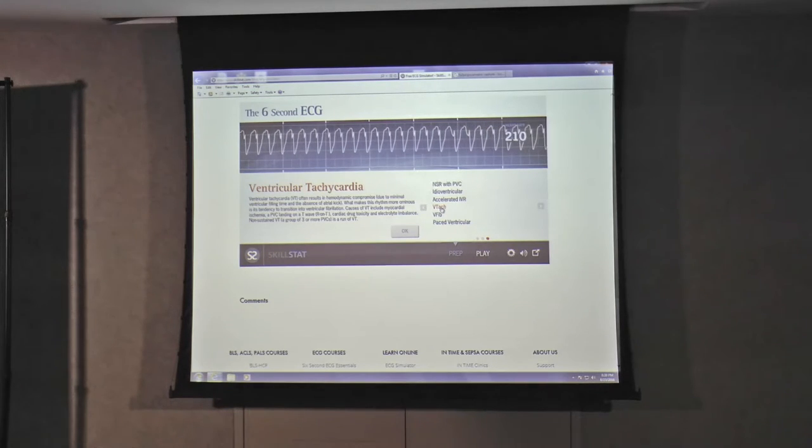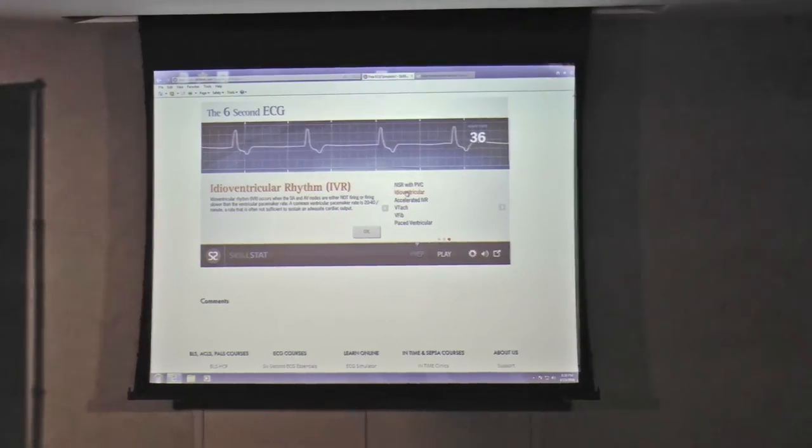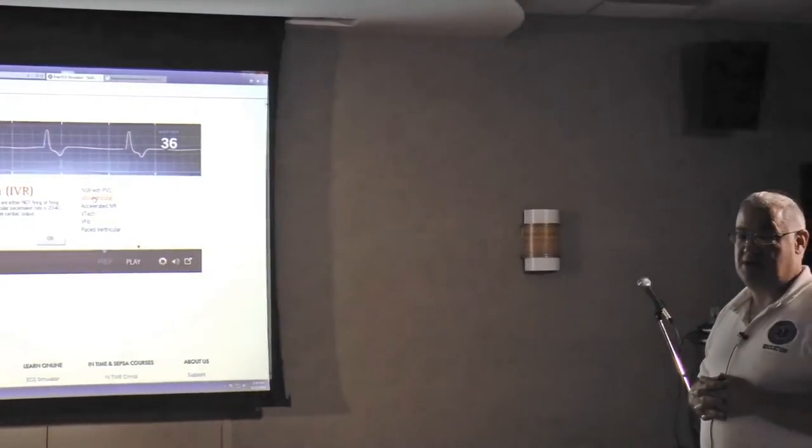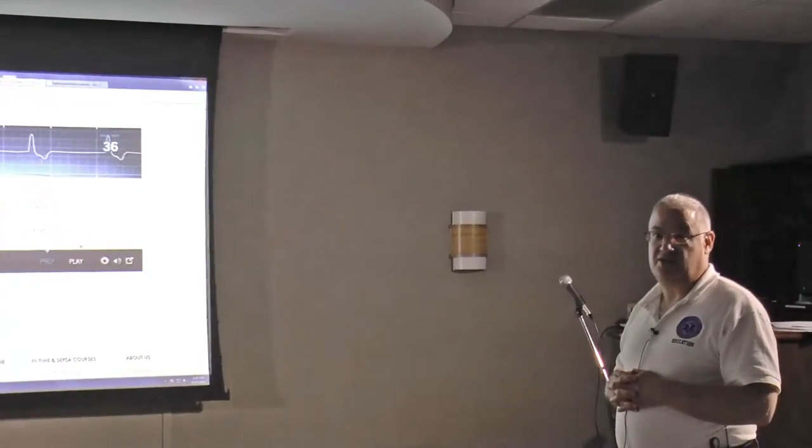be VTAC. Okay. So remember my feeling of silencing the EKG or the alarms, right? It's nice to hear, I mean, you don't have to have it screaming, but it's nice to hear that beeping noise, because if it becomes irregular, after a while your ears will come around. Right now you're just listening to the stuff for the first time, but you'll be able to tell what's going on by listening to the beeps. If it becomes irregular, you'll notice it.